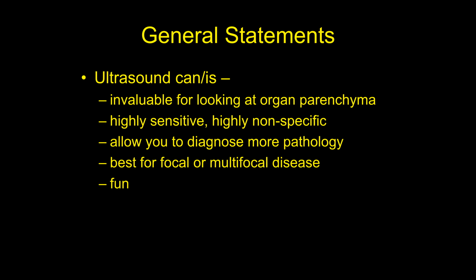On the other hand, there are some disease processes that can affect the liver and cause it to appear absolutely normal. It causes no derangement of the architecture of the liver at all. An example of that a lot of times would be mast cell disease, which is a cancer. Okay, it can live in the liver, but sonographically, the liver can look completely normal, but it doesn't mean it is normal. So it's sonographically normal, but you can still have abnormalities. An infection in the liver, hepatitis, sometimes the liver looks completely normal, but you'd have to stick a needle in it to know for sure.